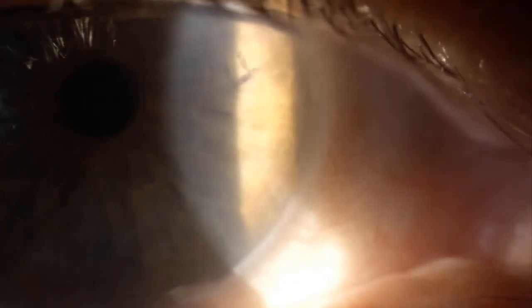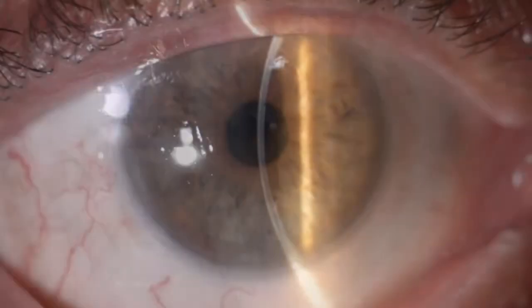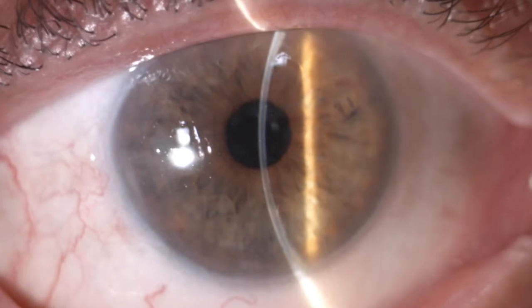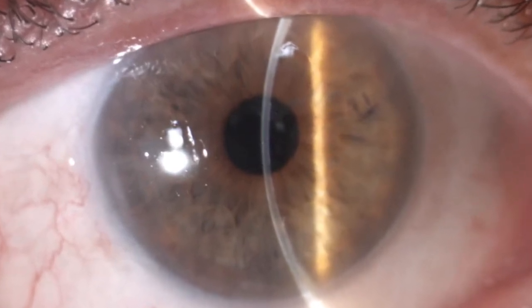As early as four days postoperatively, the cornea is perfectly transparent in the absence of air in the anterior chamber. Two weeks after DMEK, vision is 20/20 without correction.